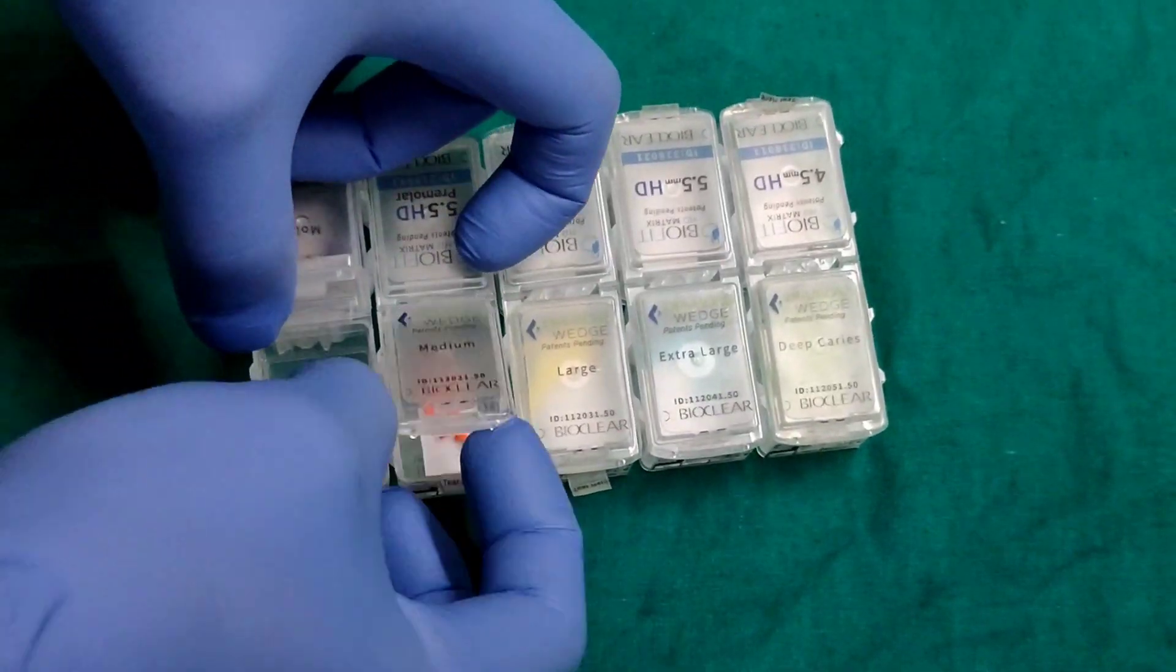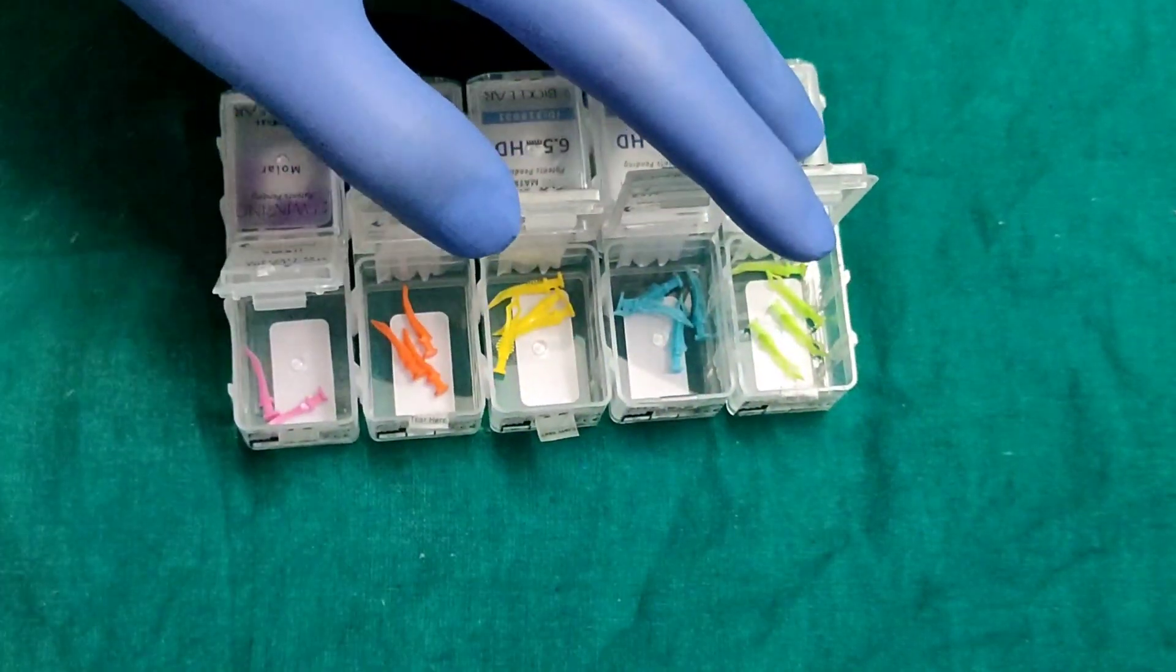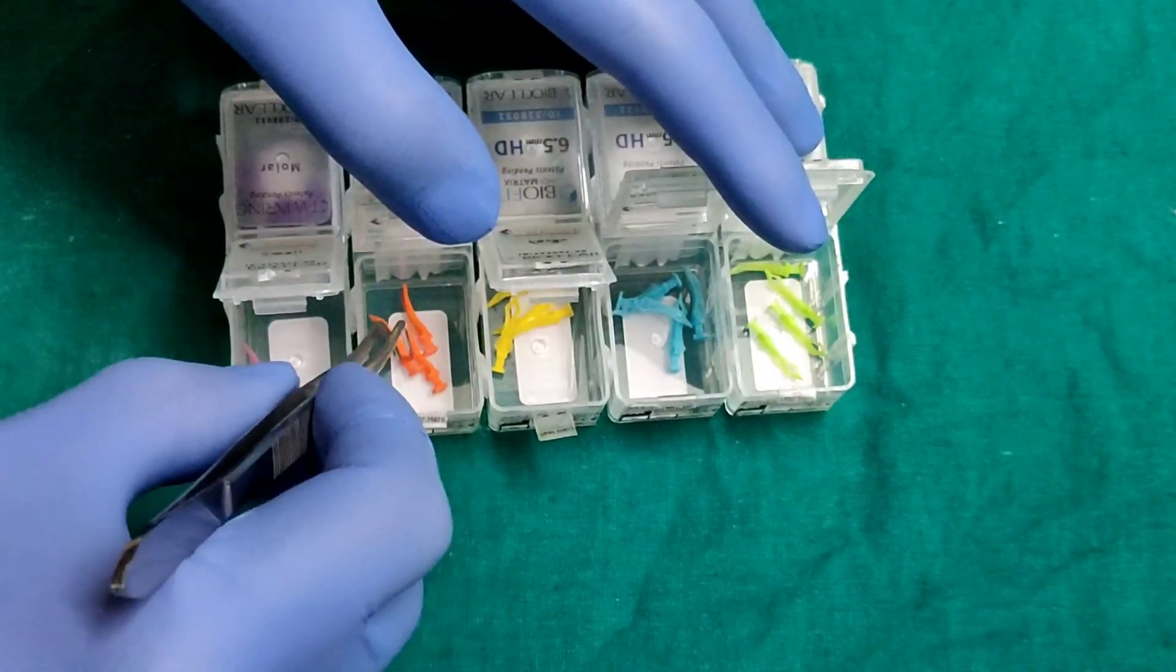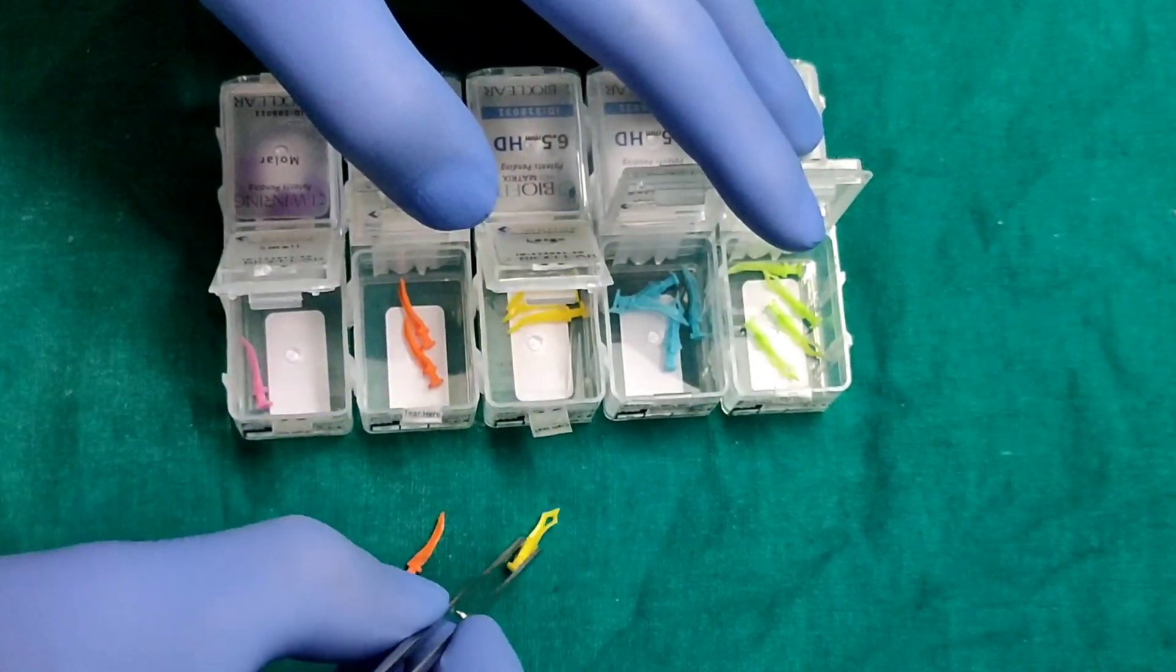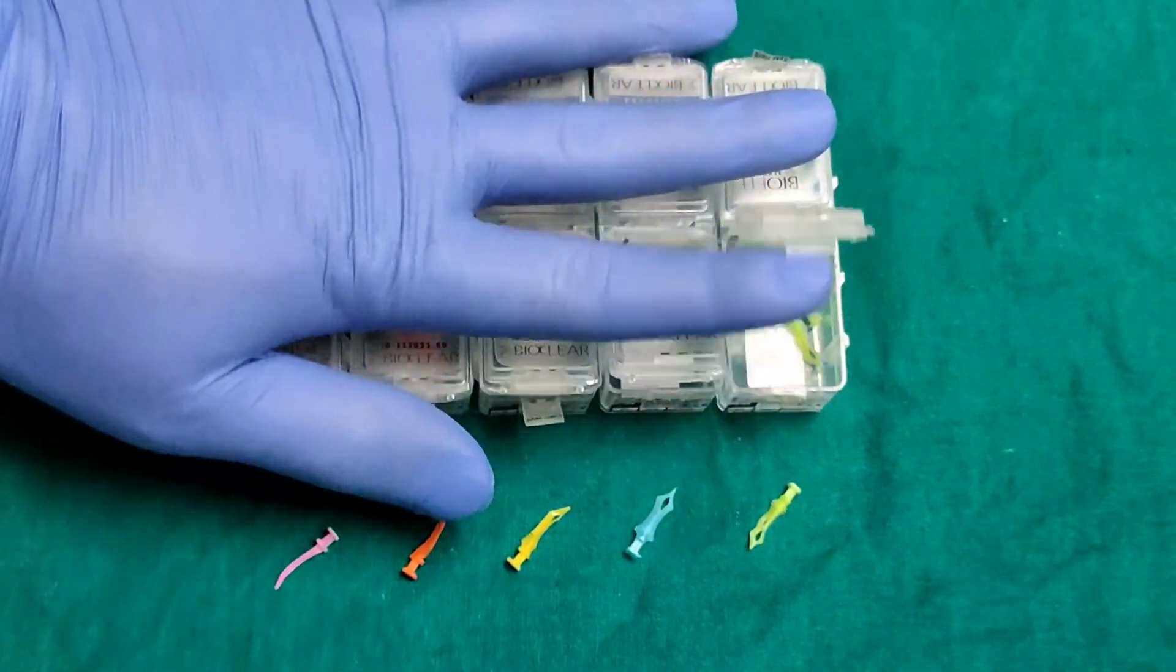Then coming to the BioClear diamond wedges. These wedges come in various sizes: small, medium, large, extra-large, and deep caries. We can use it according to the size of anatomic embrasure.